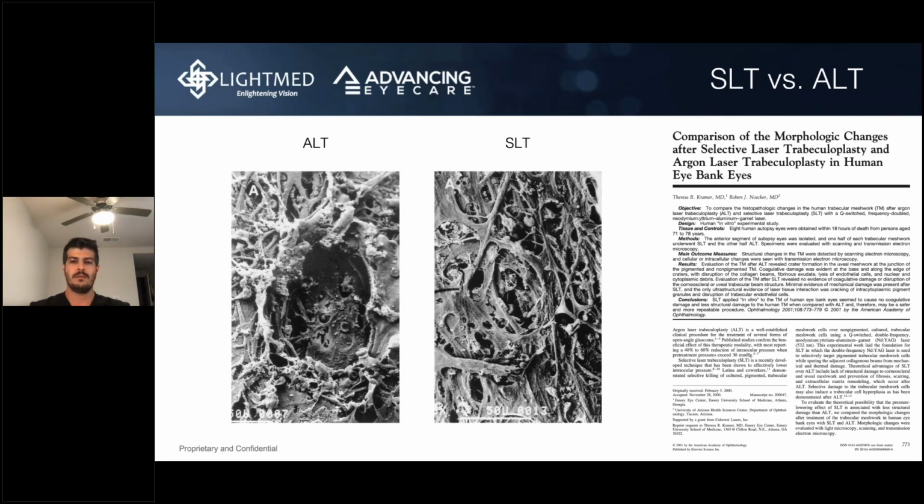Do you use SLT to try to get patients who are desiring to get off of some of their drops to decrease the treatment burden? And how successful has that been? The answer is yes, and very successful. Since I came to this practice, I essentially inherited the patients of another doctor in the community. And my number one job for a lot of these mild to moderate glaucoma patients on eye drops is at least telling them about the options they have.